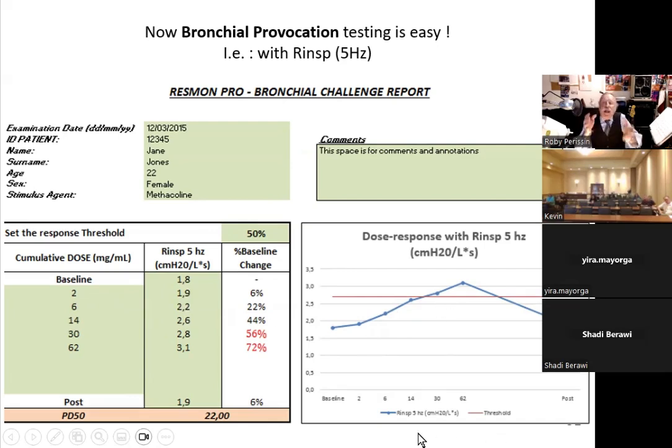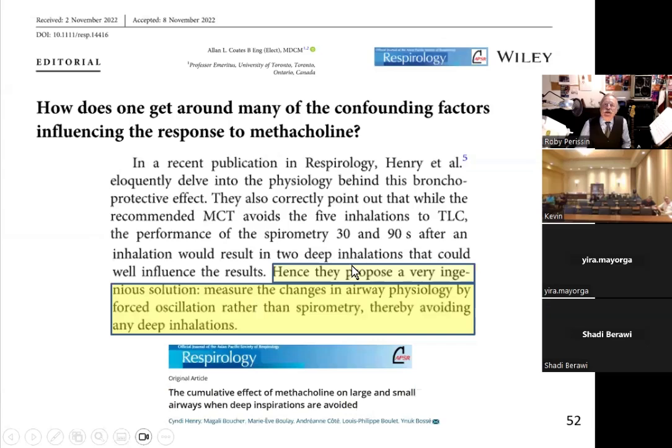And then you do bronchial reversibility, like with spirometry. That's it. In terms of time, whoever does it knows it is a hassle. This takes 5 times less than doing a bronchial challenge with spirometry. So many people around the world have restarted doing methacholine challenge because they were fed up with the time it takes and with the discomfort to the patient.